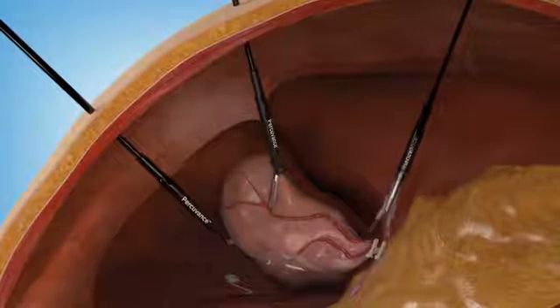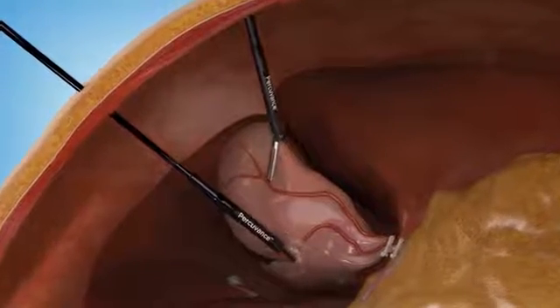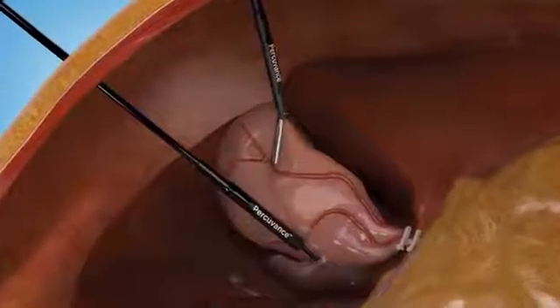The Percuvance system is engineered for a wide range of laparoscopic procedures, providing all the versatility and performance you get with traditional lap instruments.